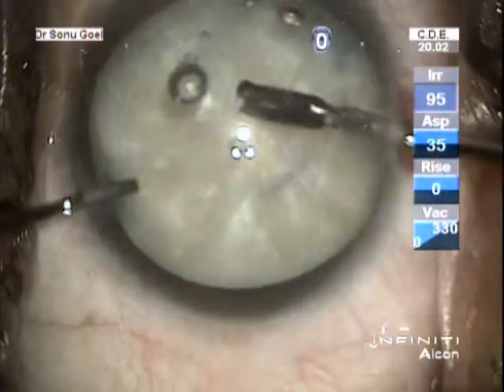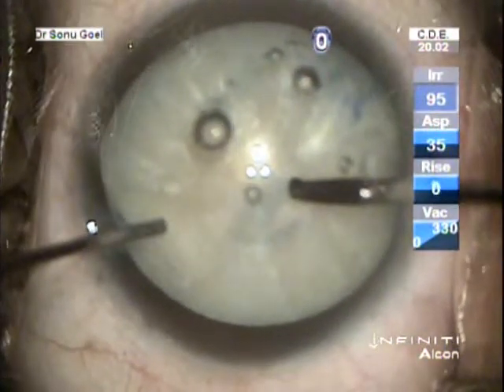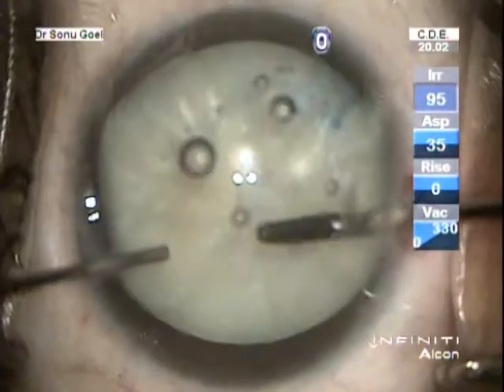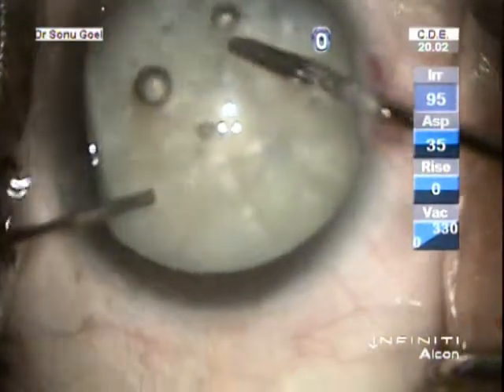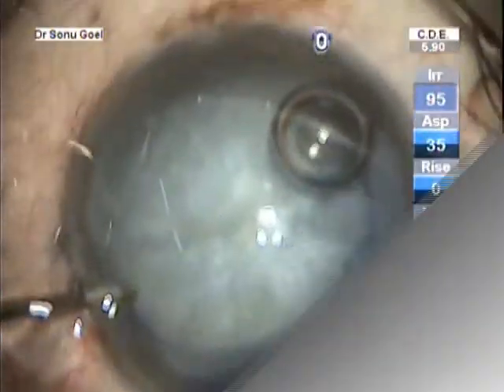micro rhexis forceps, and viscoelastic is being injected through the side port. And a beautiful round regular rhexis.